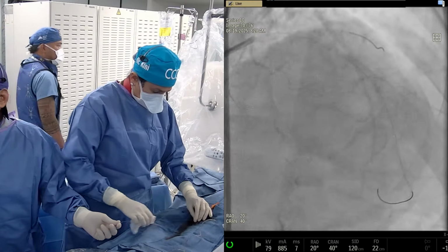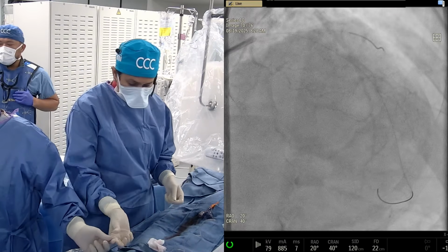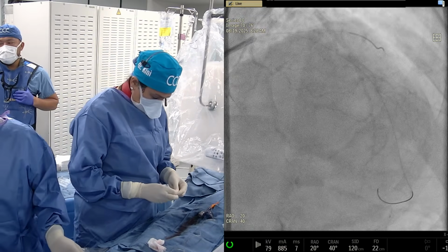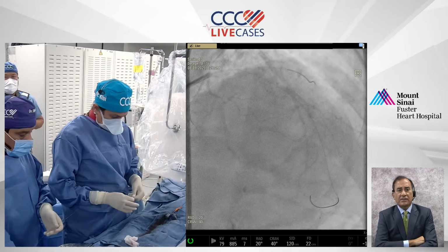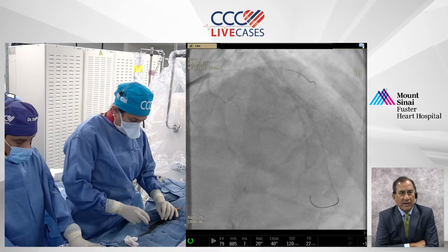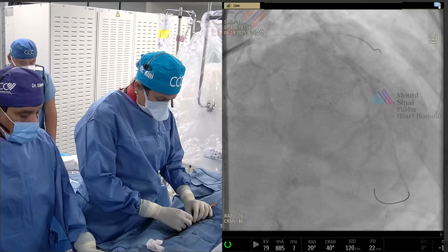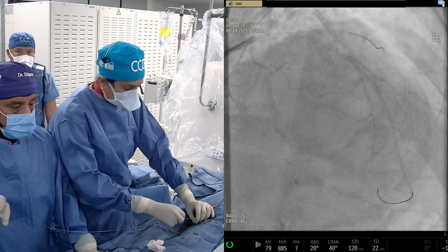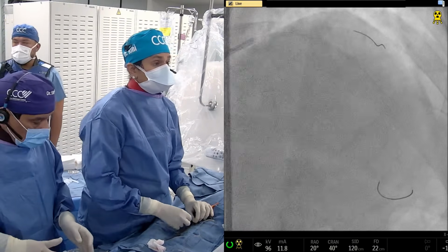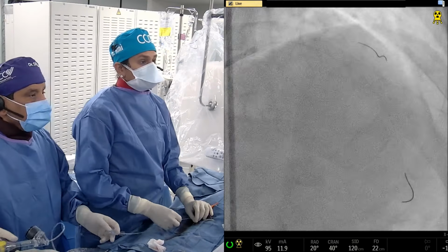We are going to use a new stent now. It will require 2 stents anyway. So I am, Samin, unaware of this balloon, the Aperta balloon. Now, what is the Aperta balloon? Maybe somebody can put in the device. Can you check the device? I'm inquiring of our audience, and we'll find the answer. Pull your wire back.